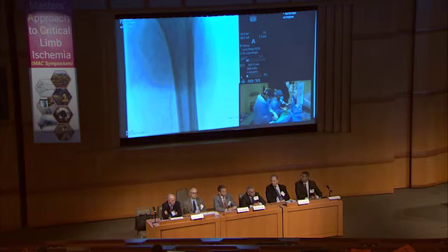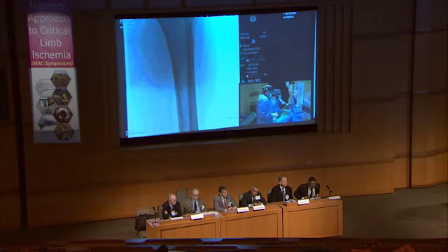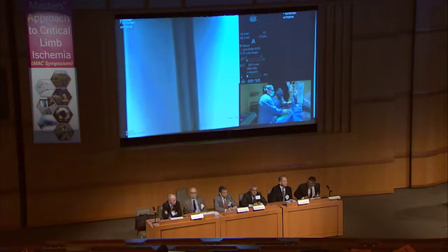So that looked good. Actually, better than I thought it was going to look. It's a nice result in the PT. Mehdi, can you play that angio again? Yes, I'll play it again. Sure. I'm just going to hit that peroneal one more time. Let me just hit the peroneal, go down, because I think the distal peroneal needs a little bit of work with the 2.5 balloon. So let me just do this and then I'll show you the whole thing.